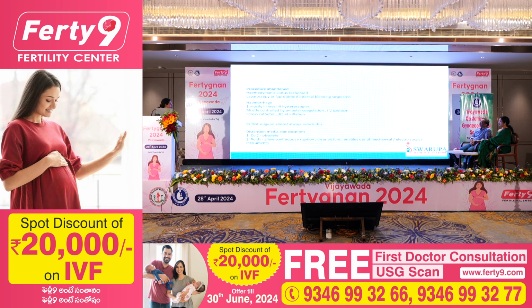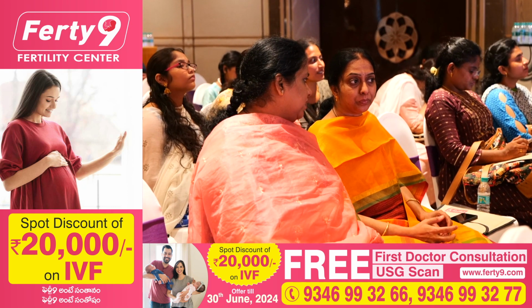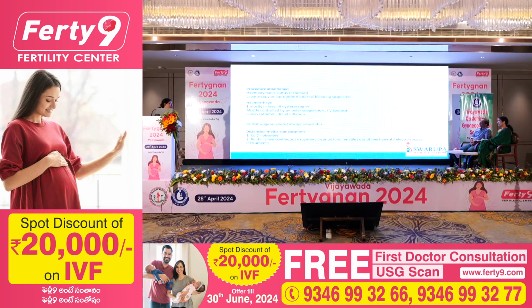And hemorrhage usually happens in level 3 hysteroscopies. This is mostly controlled by unipolar coagulation, an oxytocin drip, or a Foley's catheter which can be dilated to around 30 ml. A skilled surgeon will almost always avoid this.